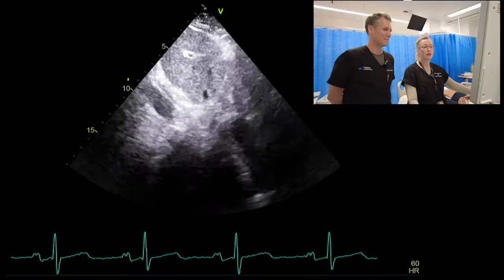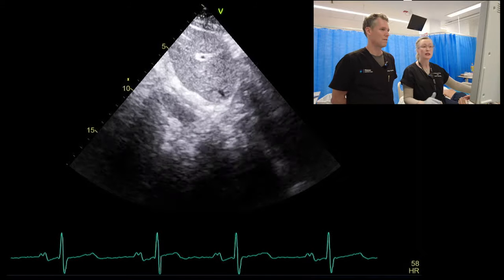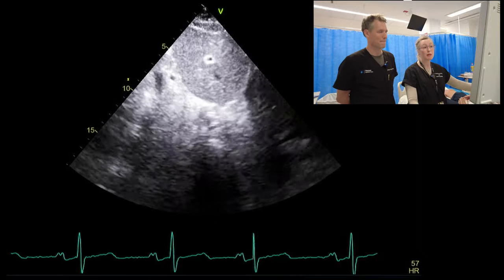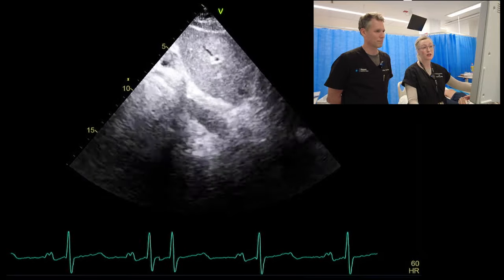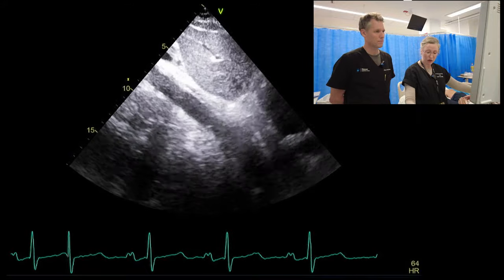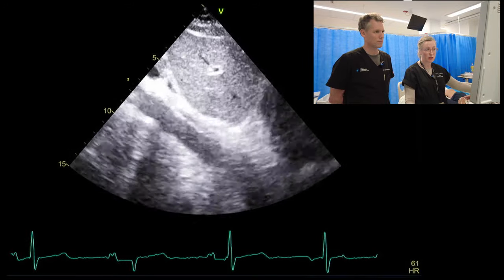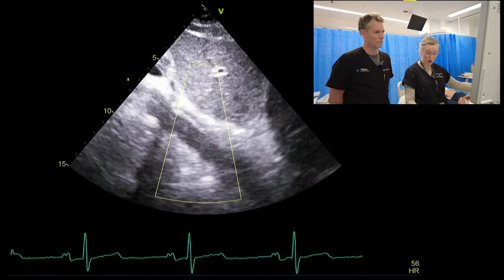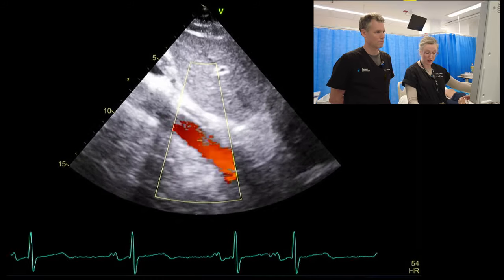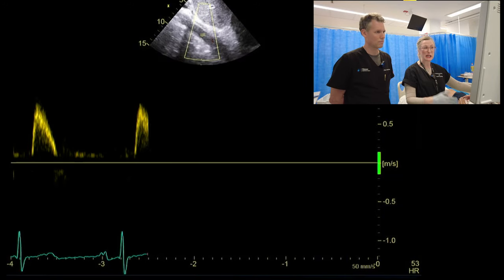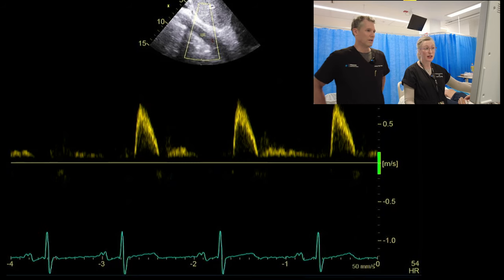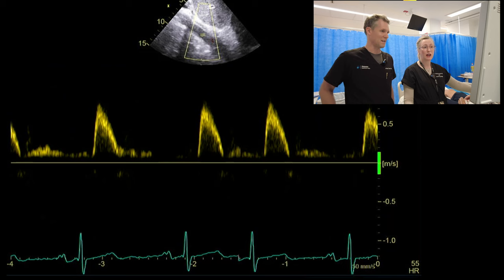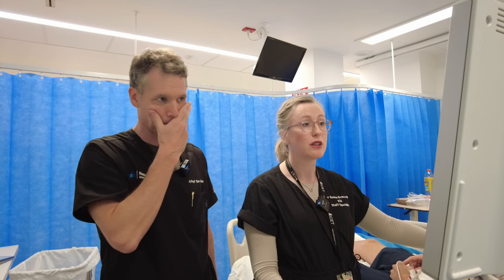The IVC size is important, especially when we're looking at the systemic baffle, which we'll talk about when we go through his anatomy. Tilting medially, we try and get the aorta in long axis, and what we'd do is reduce the depth, put some colour on that, and we should see nice normal pulsatile flow. We can put pulse wave Doppler in that just checking that we haven't got things like a coarctation, which would then show some diastolic prolonged flow — something they love putting in the ASE exams. So that all looks pretty normal.